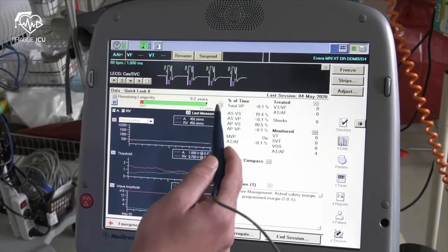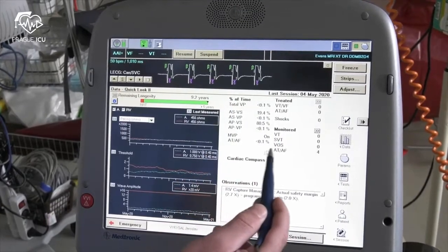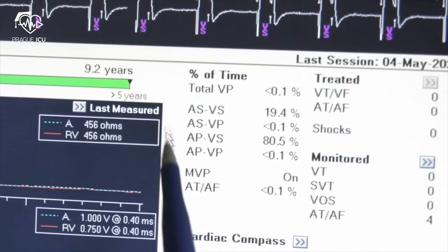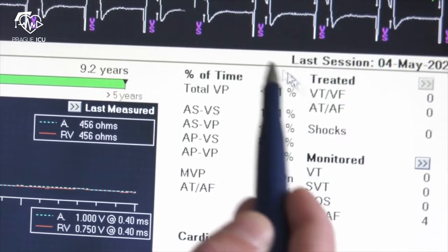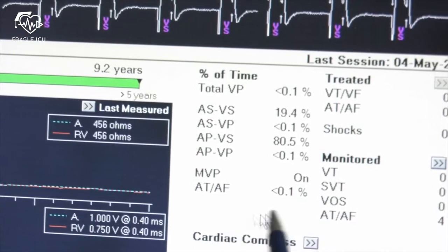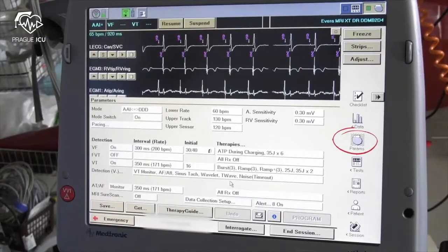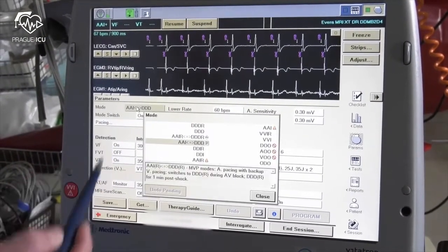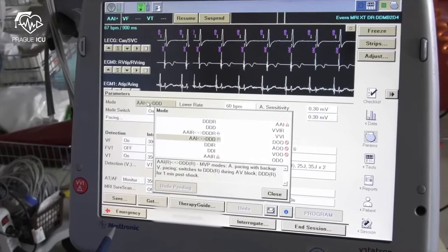In the middle of the home screen you can assess the sensing and pacing statistics. By clicking on the params icon on the right side of the screen you can appreciate all device settings.